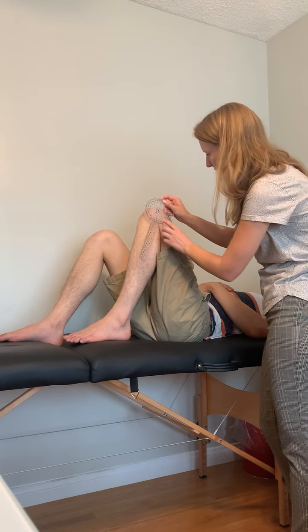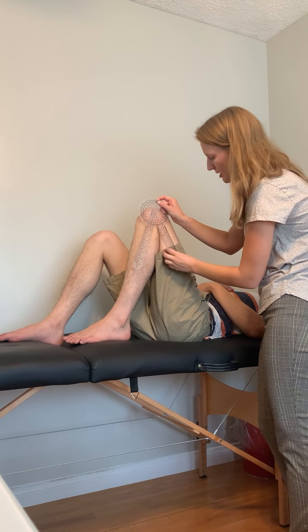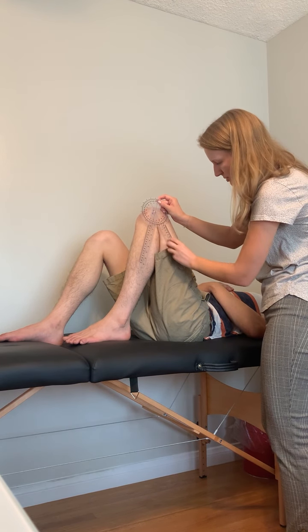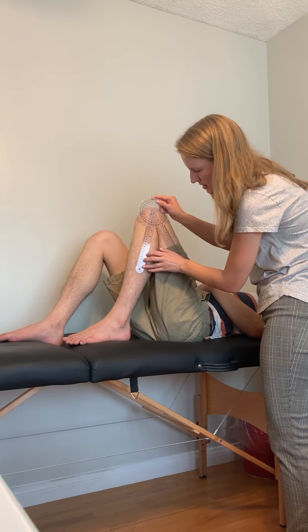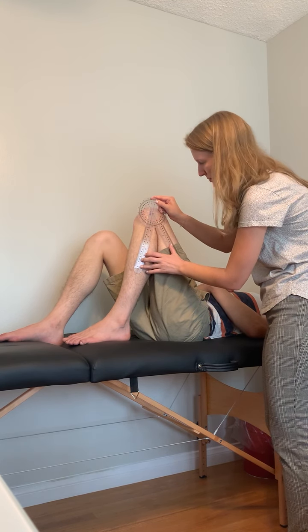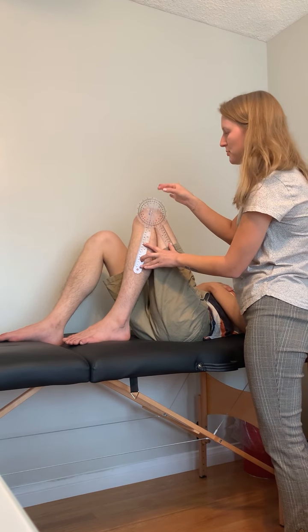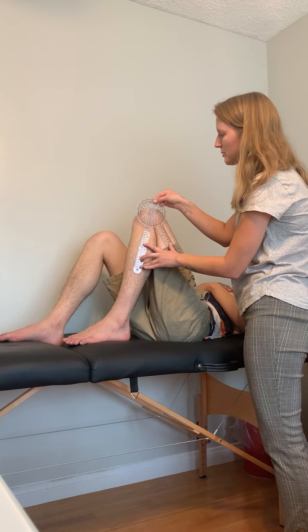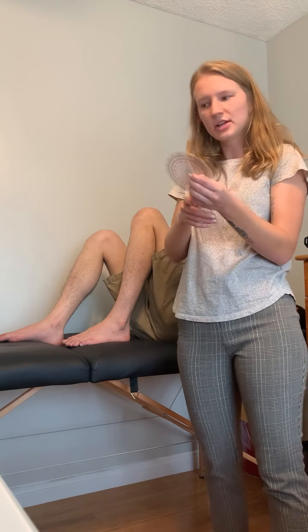We want to make sure we get everything aligned again. Make sure the axis is over the lateral epicondyle. Make sure this proximal arm is in line with the greater trochanter. Make sure this is in line with the lateral malleolus. Once we get everything lined up, we want to make sure that we pinch the moving arm to the body so that we don't lose our measurement. We'll take a look, and he has about 140 degrees of knee flexion.